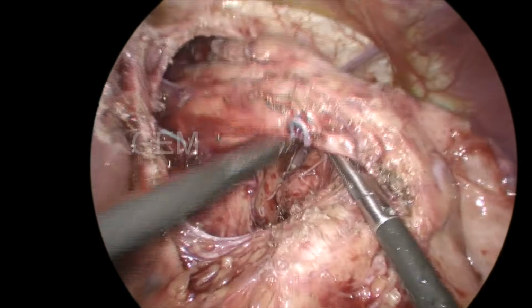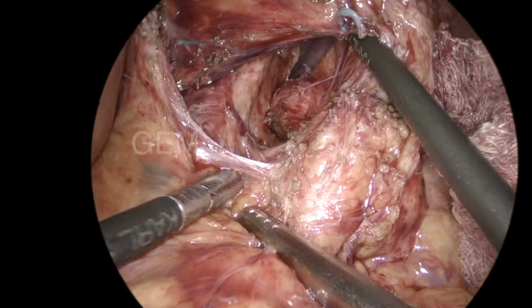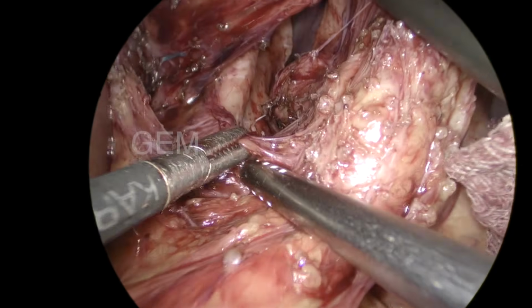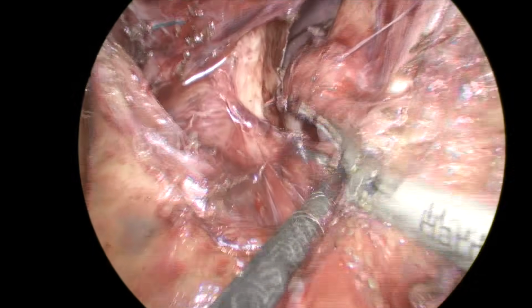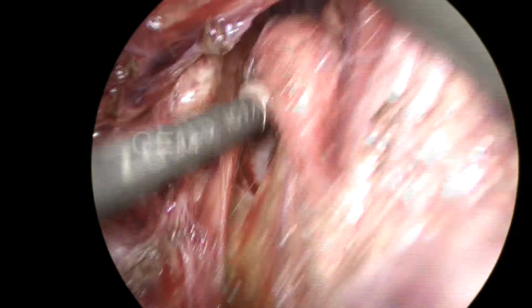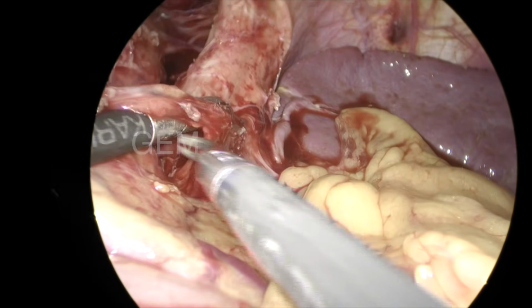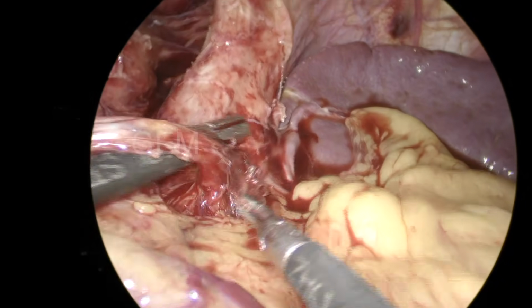Now you can see the post vagus, very thick post vagus, and again I started dissecting at the median arcuate ligament site, where both the right pillar and left pillar meet. It looks like a vessel, a posterior gastric artery going to the fundus. I do not want to divide the artery, as blood supply is always better. Again I am looking at this side. This is from the inferior phrenic vessel; one branch is going to the fundus.